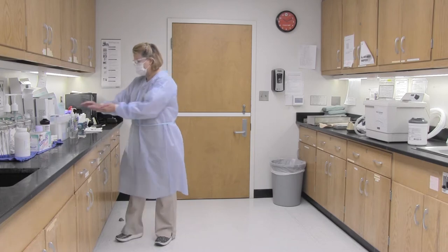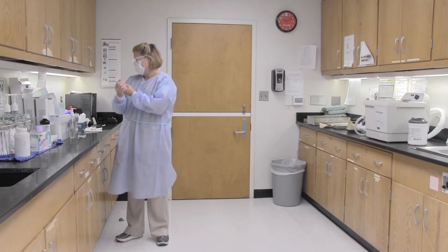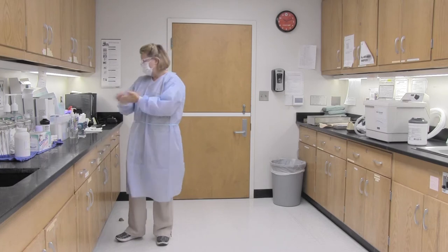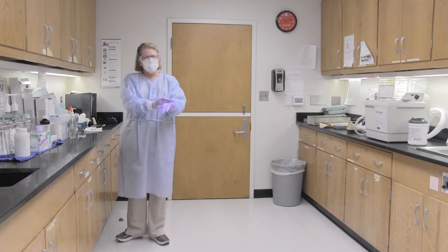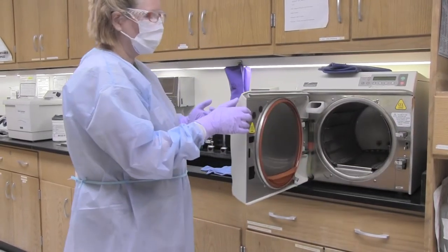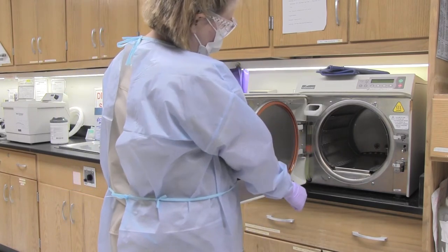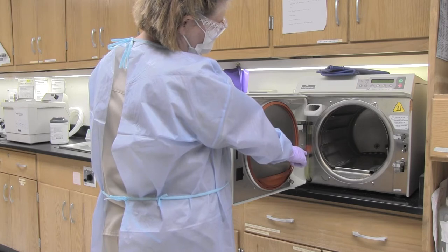With treatment-gloved hands, open the door of the autoclave unit. Always make sure that you hand sanitize or wash before putting on your treatment gloves. Open the door completely and check the water level — it should be up to the green level, at least halfway up. This is our water tube; you can see there is a red level and a green level.